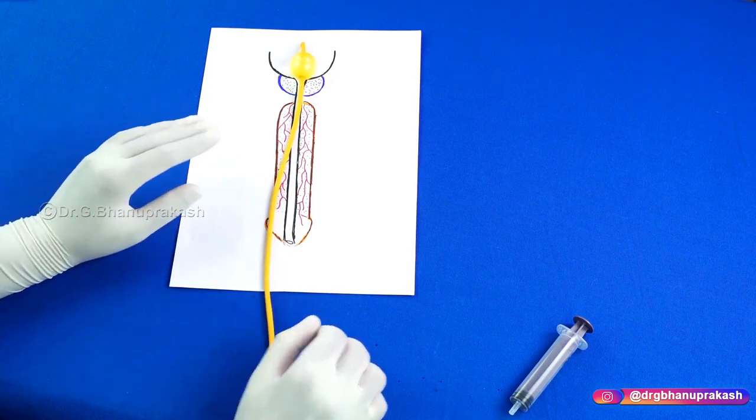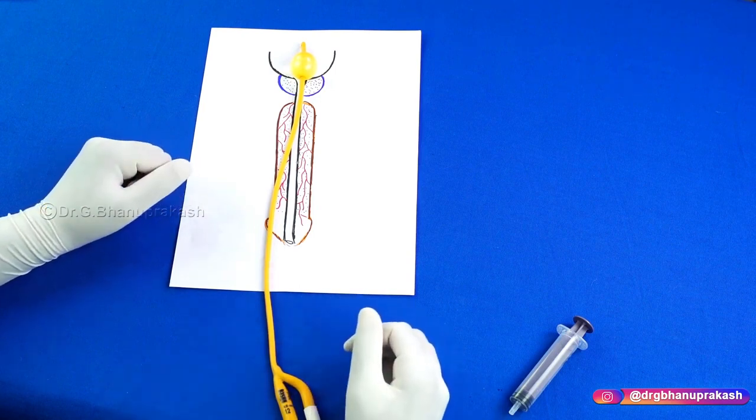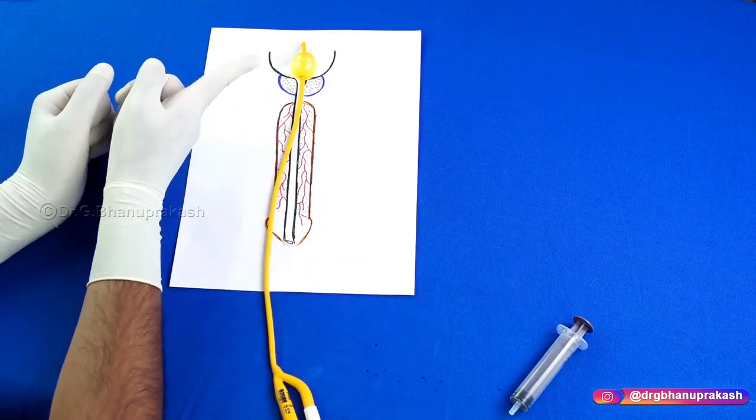Now, as I already told you, why you should not use normal saline. The reason you should not use normal saline is that you are inserting this Foley's catheter in a patient who is bedridden.